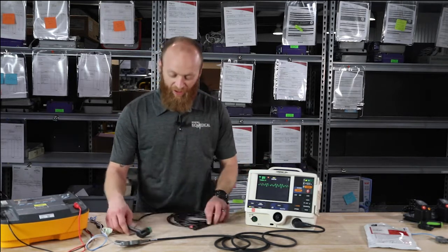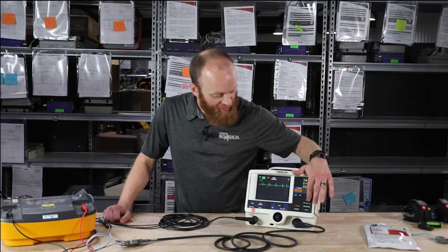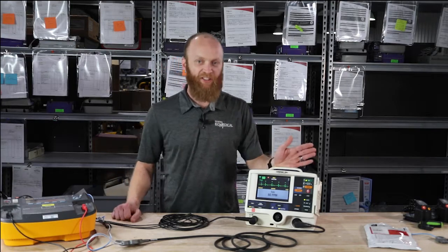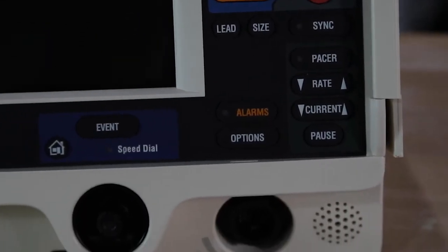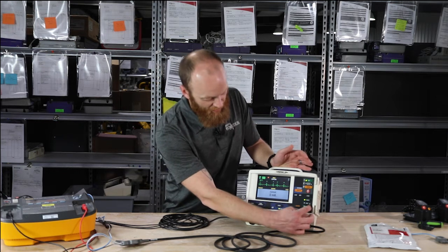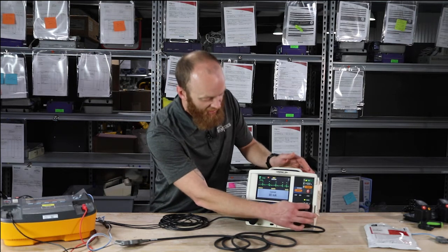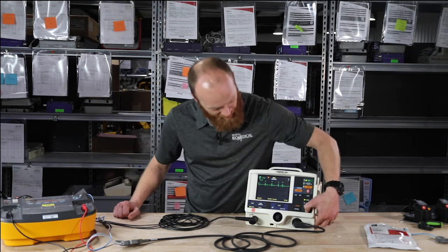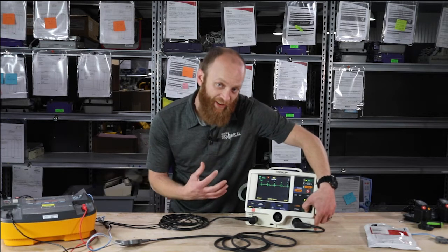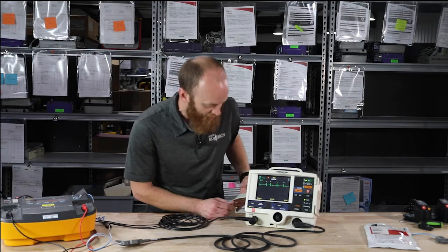As for pacing, I'm going to hook up my leads — it's a standard three-lead cable. To pace, hit the pacer key. Your LED illuminates, your rate shows on the screen, defaulting at 60 paces per minute. You can increase your rate with the up arrow and decrease with the down arrow. To gain capture, up-arrow on the current — typically around 30 to 40 mA when you gain capture. Push and hold the pause button to get your printout showing a 4-to-1 ratio, essentially zooming in to show you the underlying rhythm. You can then unpause pacing and it returns to demand pacing.